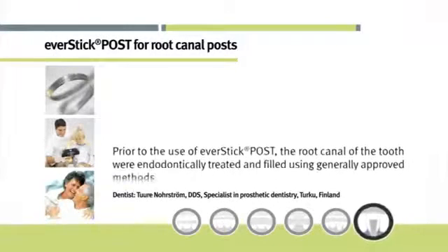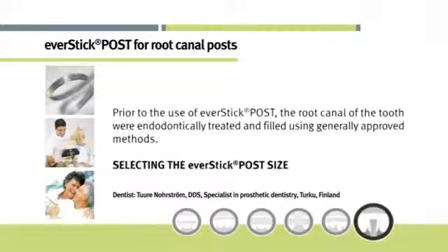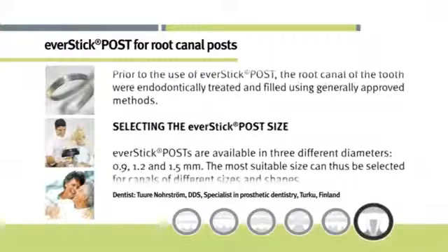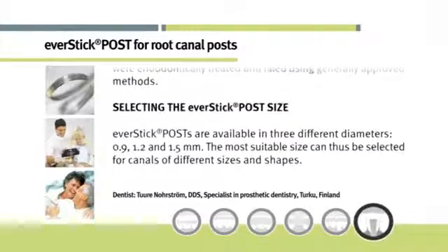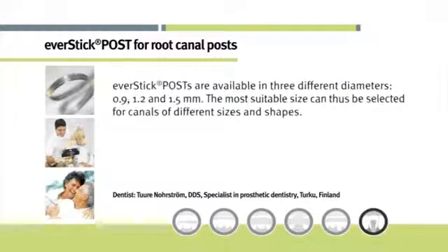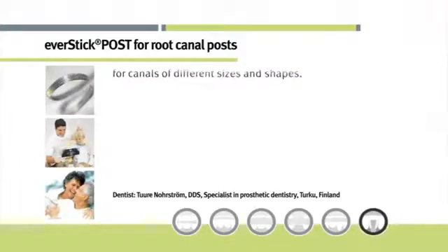Prior to the use of EverStick post, the root canal of the tooth was endodontically treated and filled using generally approved methods. EverStick posts are available in three different diameters: 0.9, 1.2, and 1.5 mm. The most suitable size can thus be selected for canals of different sizes and shapes.